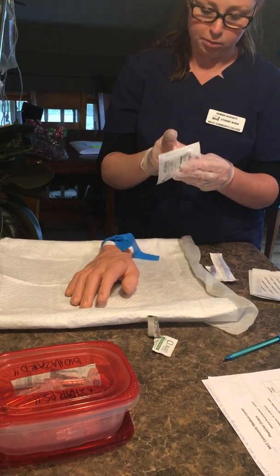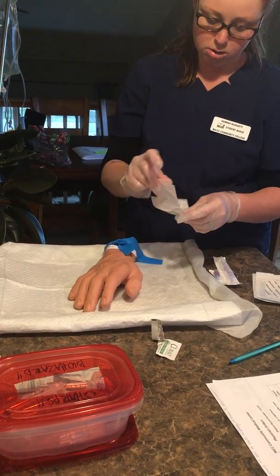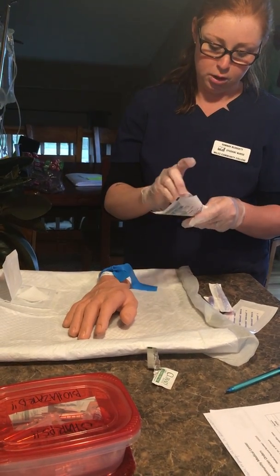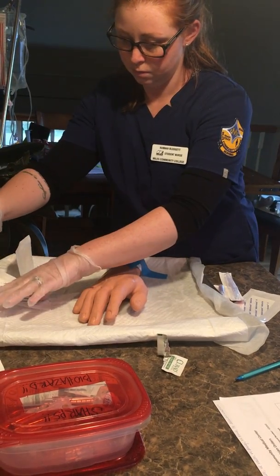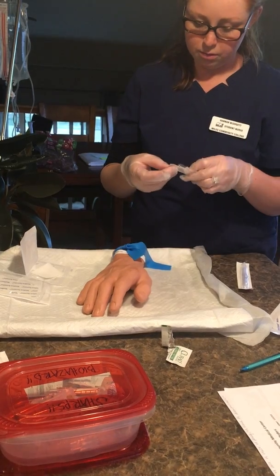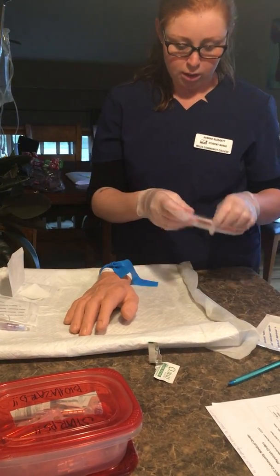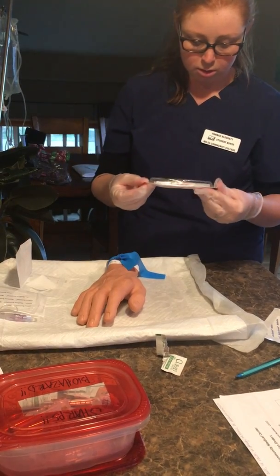I'm gonna go ahead and get these opened up. I have some gauze and dressing. And my saline lock here. And then my catheter.